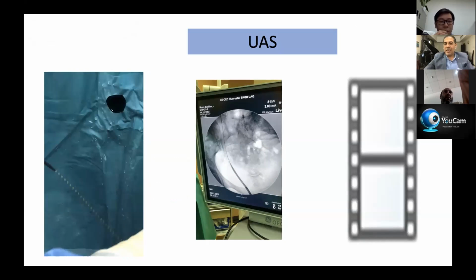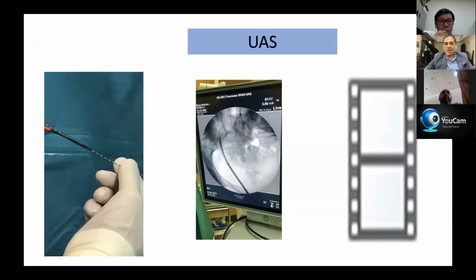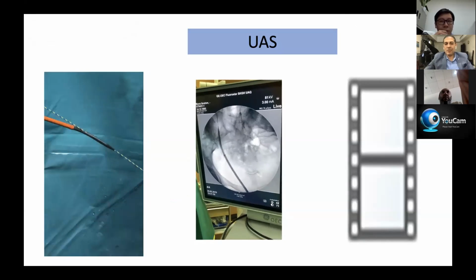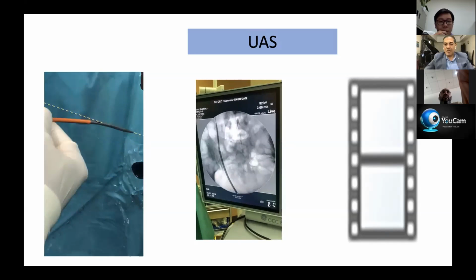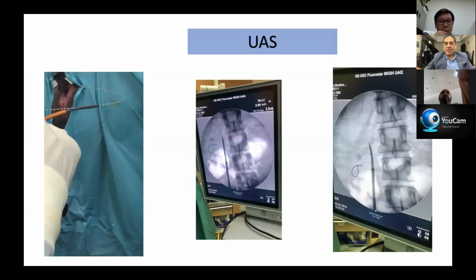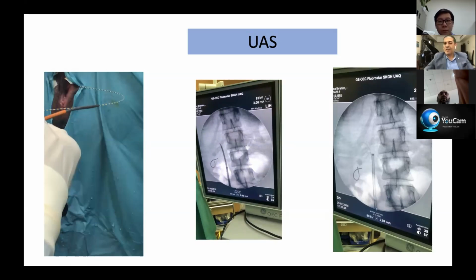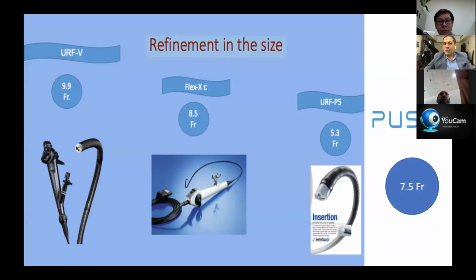And also keep fluoroscopy to monitor the introduction of the access sheath, because sometimes you have resistance, and the resistance increases when you are using a larger one. So use a safety guide wire, do not routinely use the big access sheath, and keep monitoring under fluoroscopy. It will help you avoid such injury of the mucosa, which is really a long-term complication to the patient.